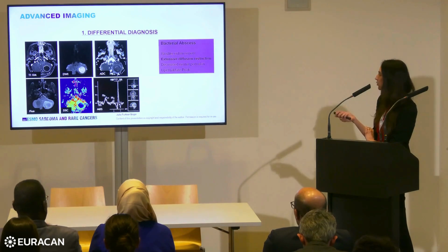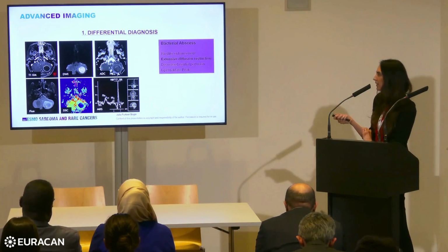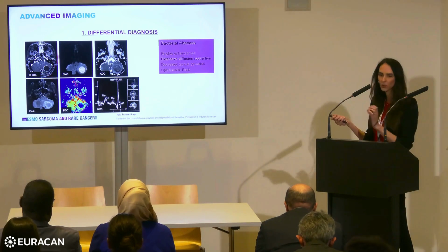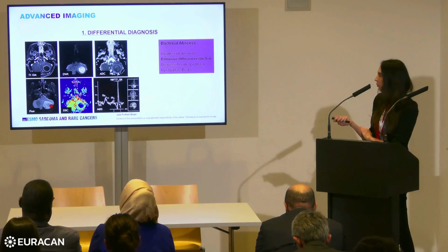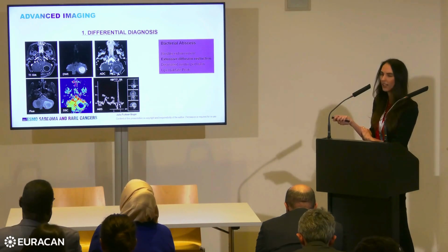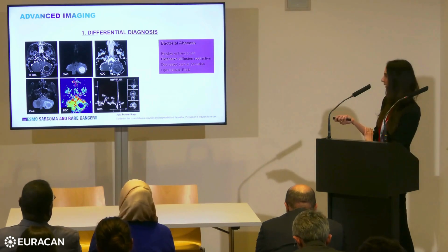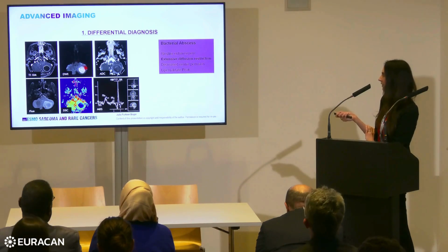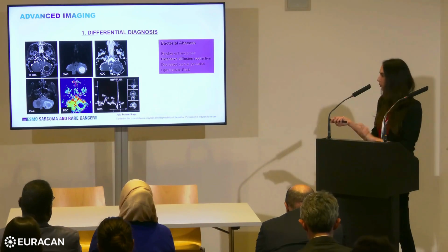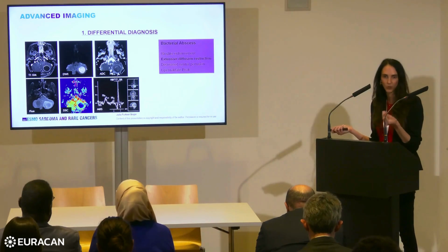When we come to non-tumoral differential diagnoses, an abscess routinely looks like this. We have this thin linear contrast-enhancing rim, the abscess capsule, like drawing a line, very homogeneous, and this is also reflected on FLAIR and T2-weighted images, where you can see this classical double rim sign, so a dark line and a bright line, also reflecting the capsule. Of course, we have no perfusion within the center and extensive diffusion restriction due to the pus. And again, in the MR spectroscopy, we have very high lipid peaks due to the cell death.